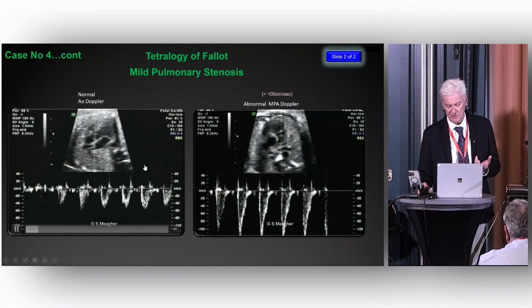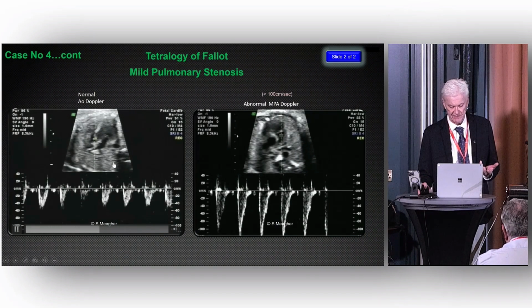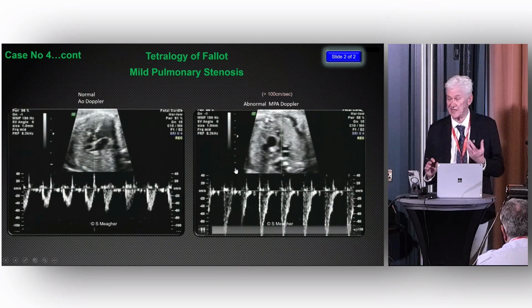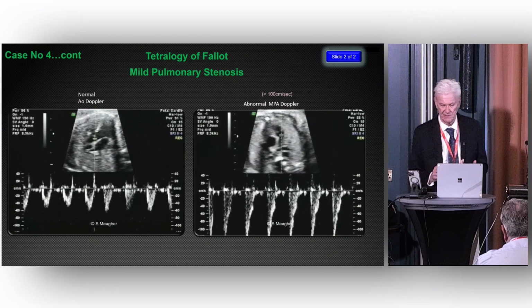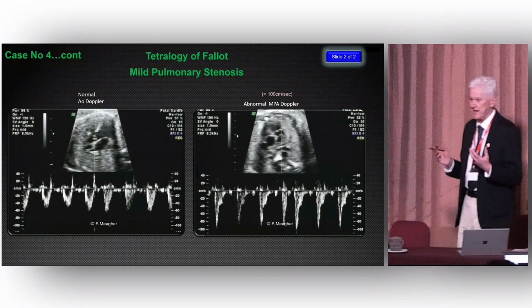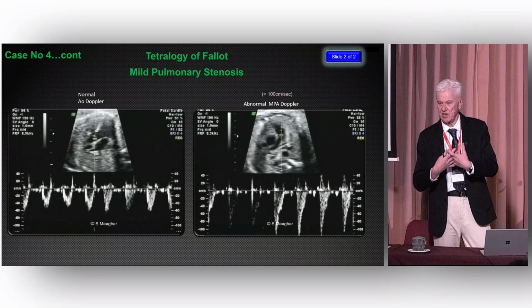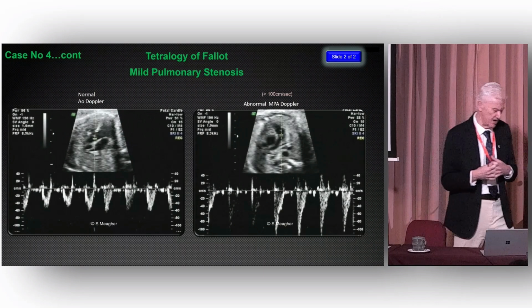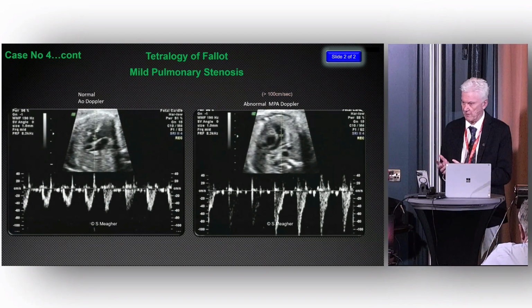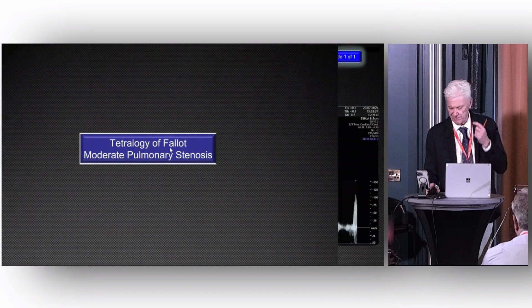And by way of comparison, this is the aorta in this scenario, sitting astride the ventricular septum with velocities in the order of 50 centimeters a second. And you can hear, in a sense, almost the higher velocity in the pulmonary artery. Remember, with regard to the pulmonary artery in Tetralogy of Fallot, for many of these it is infundibular obstruction. It's basically a muscular obstruction at the base of the pulmonary artery as it leaves the right ventricle. But there is also valvular pulmonary stenosis which coexists for many of these fellows, and it may be a combination of both.